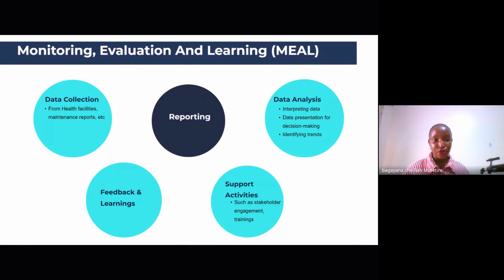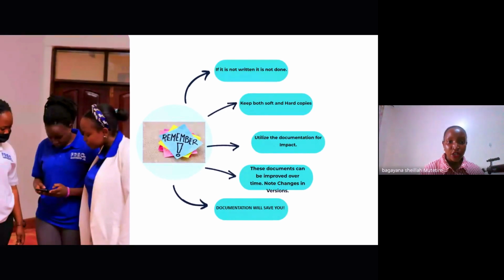Data analysis. So all this data we collect is usually analyzed, and we're able to understand the best make, the lifetime of the equipment, the spares, the costings, etc. So lastly, these are a few points that I thought are important for us to highlight.